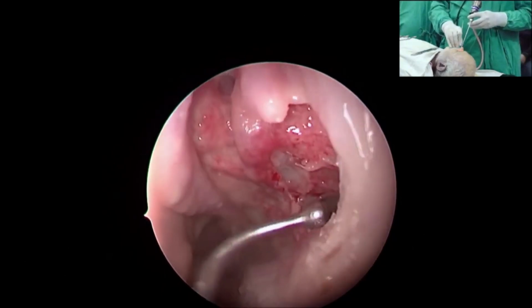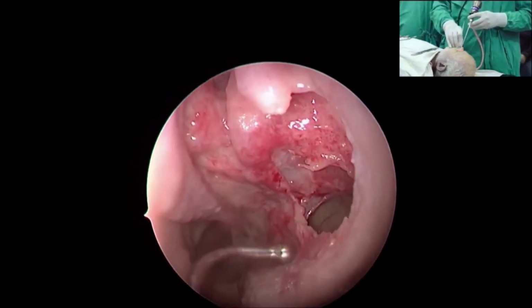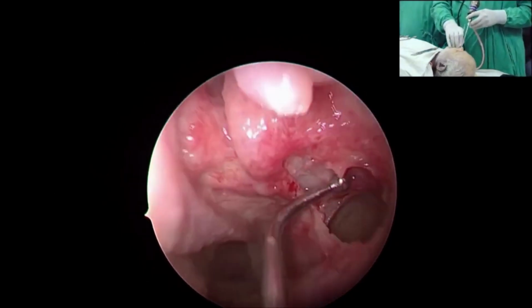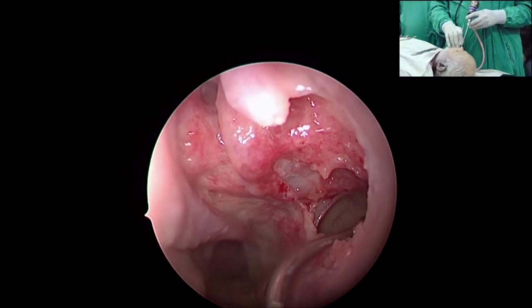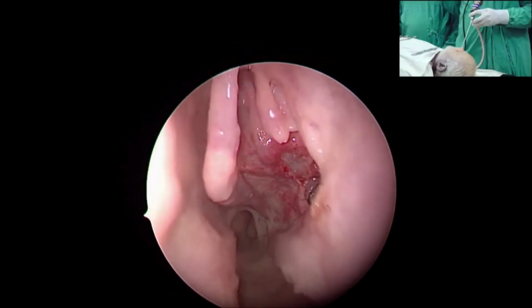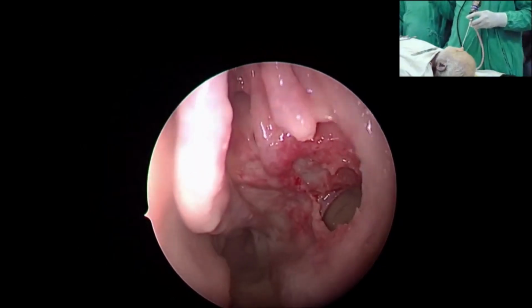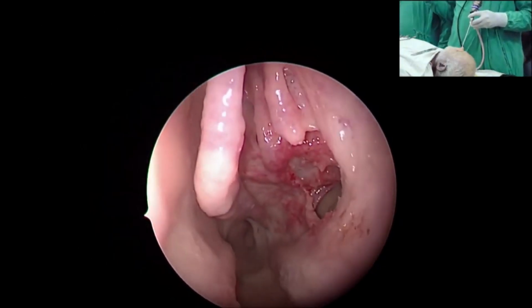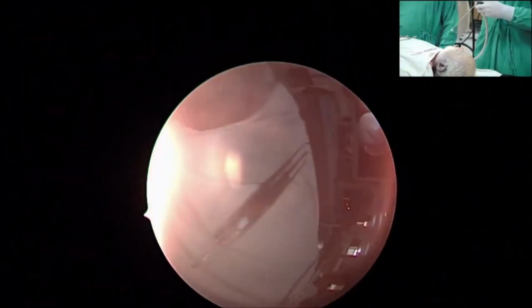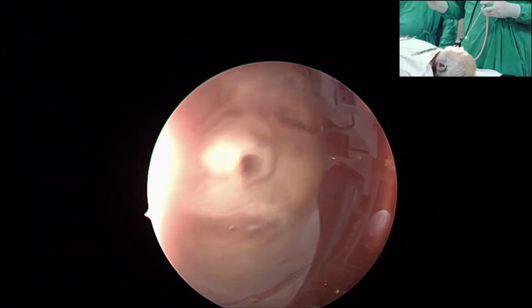So now, this size, like Dr. Prabhakaran mentioned, doesn't matter much. Yes, agree to him. And this is an adequate size for a regular sinus surgery. But, as we all know now, the indications are expanding and we are doing it for much more indications than only the inflammatory diseases of the paranasal sinuses. Why we are gathered here is for understanding the anatomy of nose to the skull base.